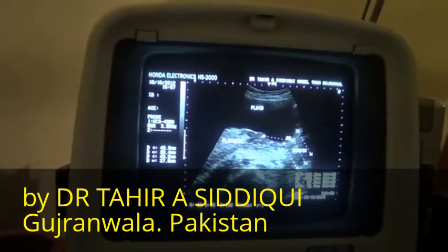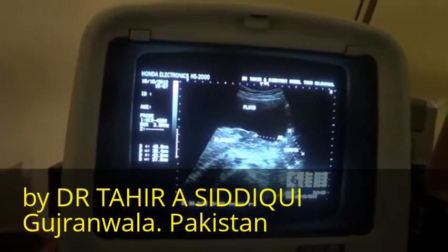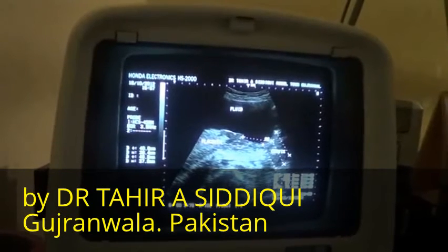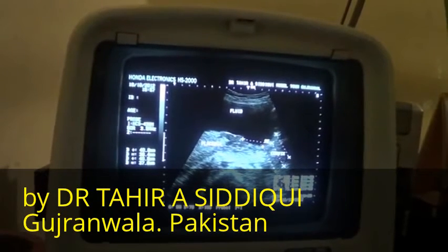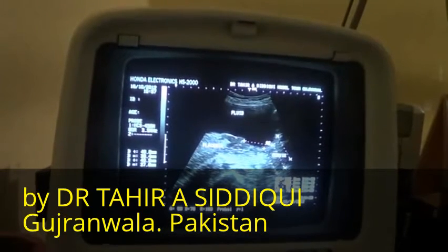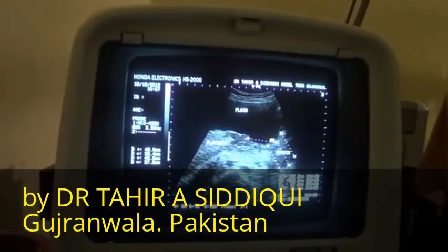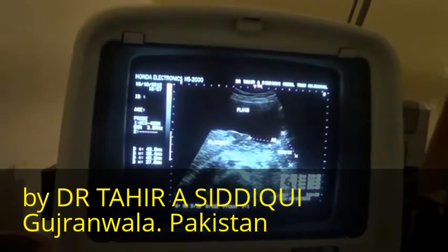Now you see that the biparietal diameter is 7.94, which corresponds to the gestational age of 31 weeks, 6 days. Femur length is 5.78, corresponding to the gestational age of 30 weeks. Head circumference is 286.8 millimeter, corresponding to 31 weeks plus 4 days.